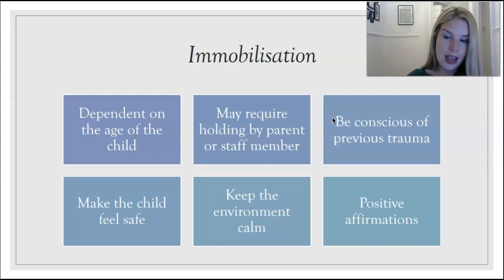We want the child to feel as safe as possible, so sometimes immobilisation can be as simple as maybe wrapping them up in a blanket, giving them that kind of cocoon warm feeling, giving them positive affirmations, so tell them how well they're doing, tell them that we're really proud of them, and just speaking in a very calm voice. The last thing you want to do is be a radiographer who's like a bull in a china shop. You really need to be calm. You need to make sure that the patient feels safe, and kind of speak to them almost like a kind of hypnotic mindfulness technique, and that can really help immobilise them and help keep them safe and keep them happy.